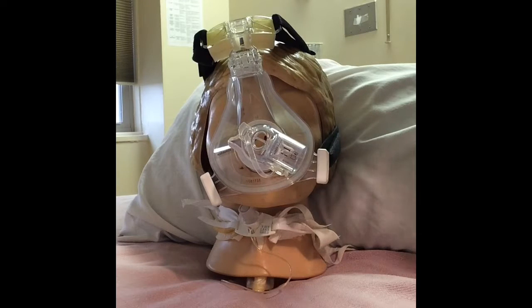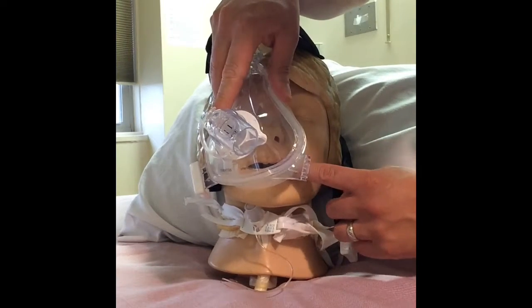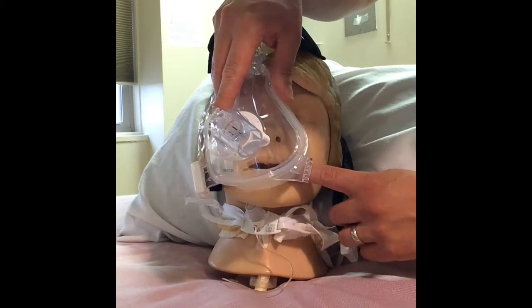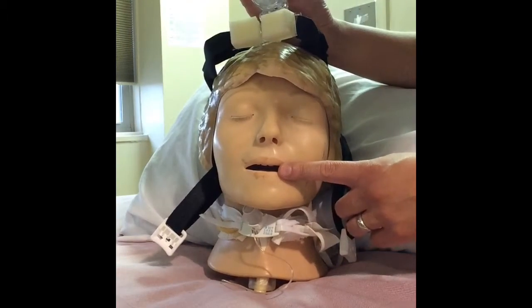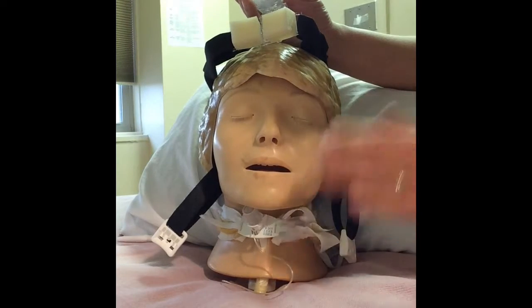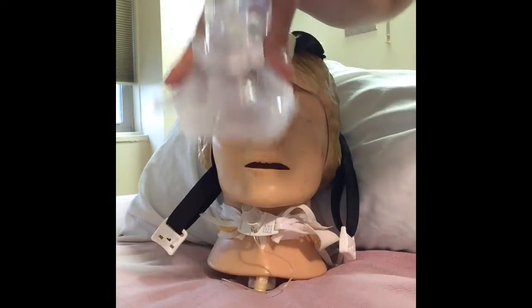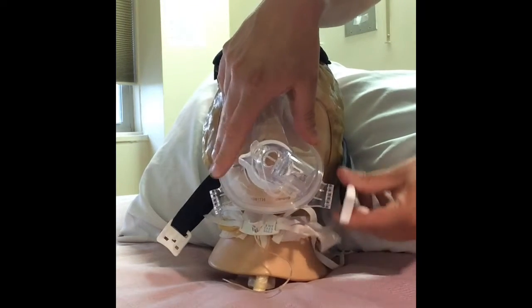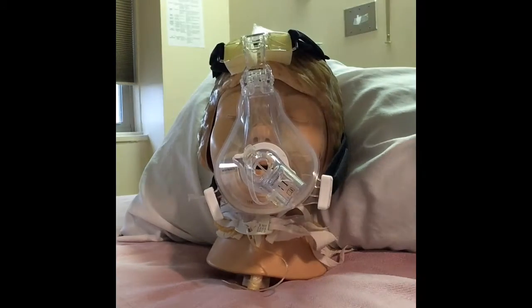You never want to try and give your patient a drink of water just by taking off one clip, sticking the straw in their mouth, and then allowing them to take a drink. This mask needs to be completely taken off. Allow them to have their drink of water or whatever they want to eat. Allow them to swallow that. Once they don't have anything in their mouth, then we can reapply the mask. And then you're good to go.